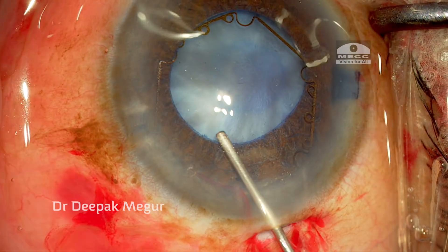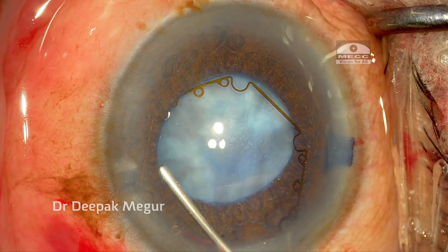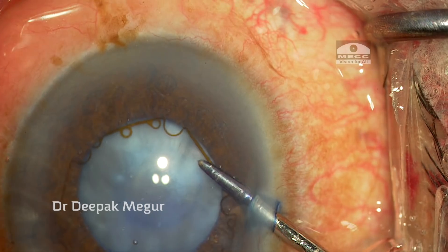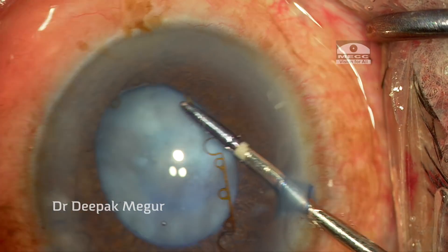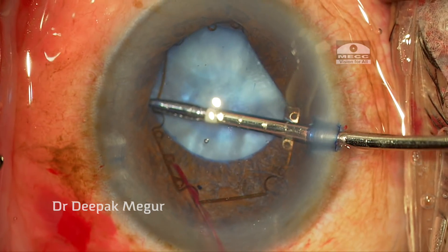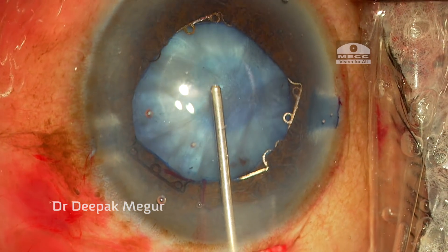I'm putting the OVD under the iris so that it lifts the iris up. The idea is I don't want to damage the anterior capsule while manipulating the ring. Using 23-gauge forceps through the side port, each of the notches of the ring are engaged into the pupillary margin and I get a decent pupillary size opening.